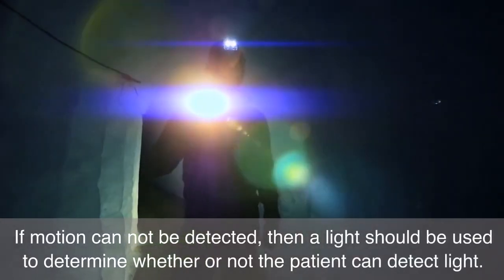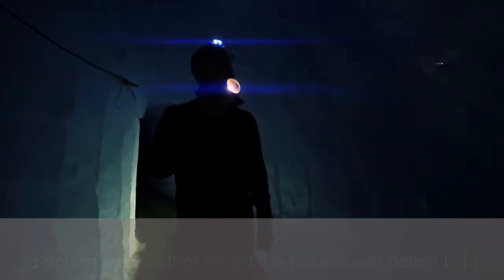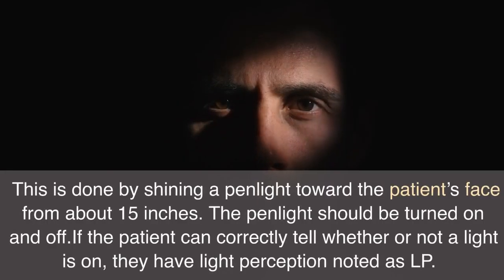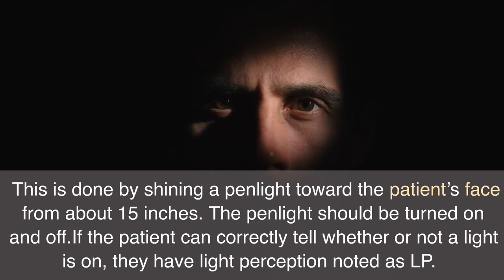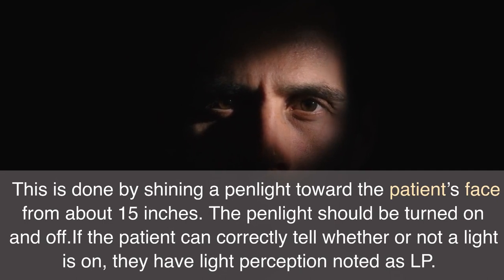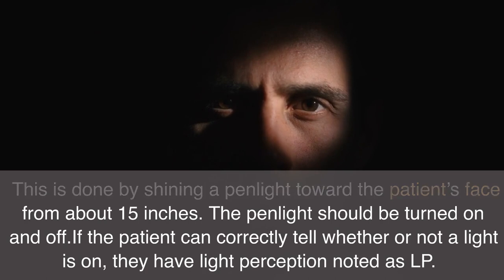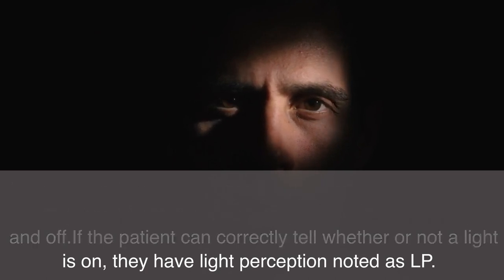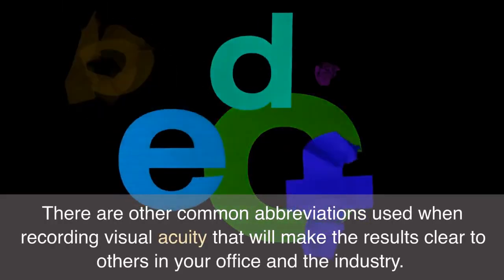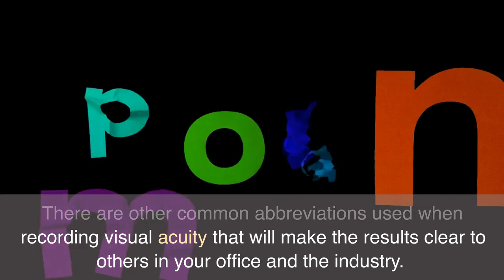If motion cannot be detected, a light should be used to determine whether the patient can detect light. This is done by shining a pen light toward the patient's face from about 15 inches. The pen light should be turned on and off. If the patient can correctly tell whether or not a light is on, they have light perception, noted as LP.